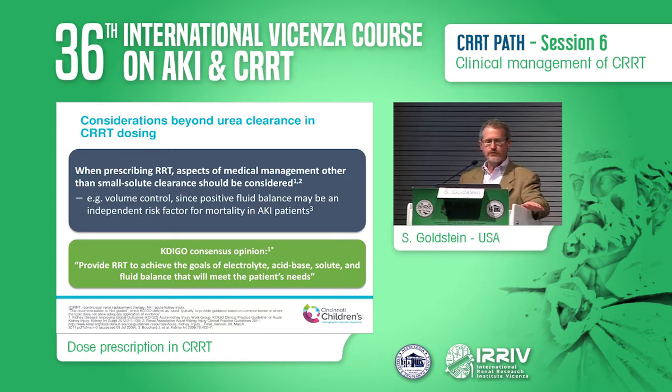When prescribing renal replacement therapy, aspects of the medical management other than small solute clearance should be considered, including volume control, since positive fluid balance may be an independent risk factor for mortality in AKI patients. And so the goal is to provide RRT to achieve the goals of electrolyte, acid-base, solute, and fluid balance that will meet the patient's needs.